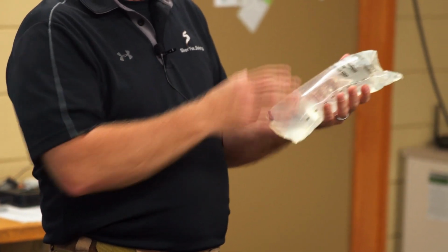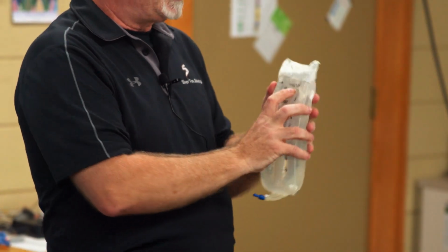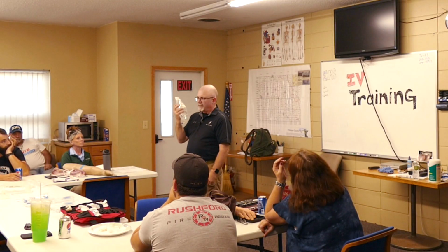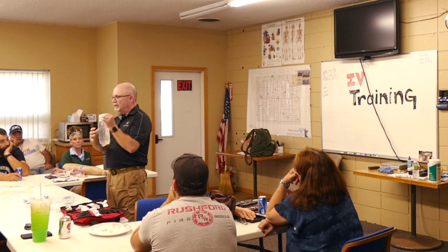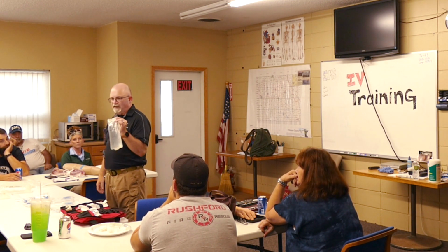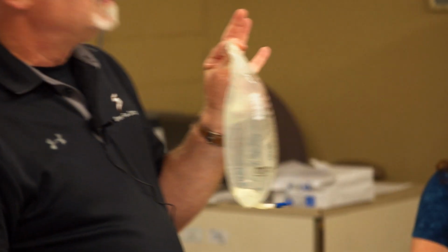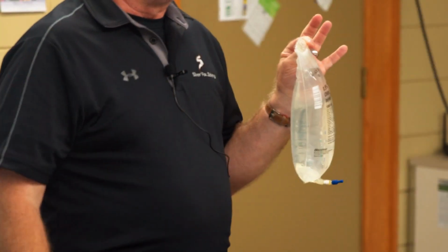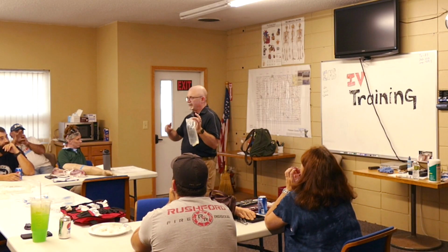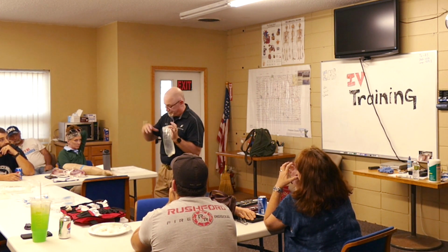In any case, I'll do another philosophical question. This is just a Johnism, but let's say we had one that expired in July of '23, and it's the only thing you've got. You've got somebody with a crappy pressure, looking like poo-poo. You need a port in a storm. Okay, do that. Make sure you write up an incident report, let the boss know and the doc know, and go. It's forgiveness versus permission. That's just my opinion, but the same kind of idea applies: for whatever reason, this is all you've got.